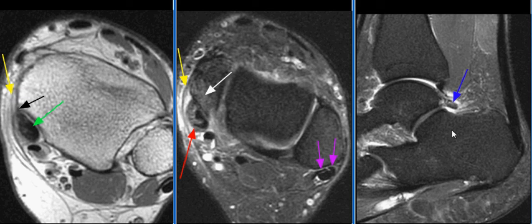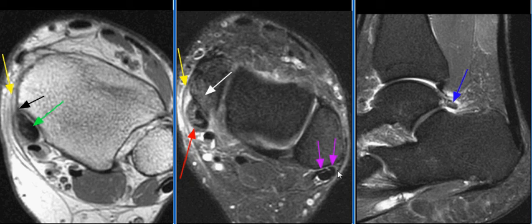A small os trigonum is seen with mild edema and adjacent synovitis. There is moderate peroneus brevis tendinosis with a longitudinal split tear at the level of the lateral malleolus.